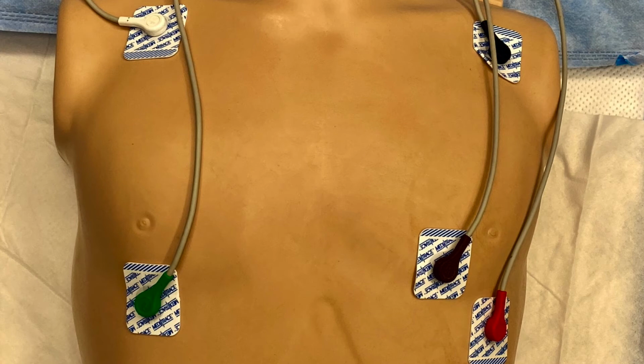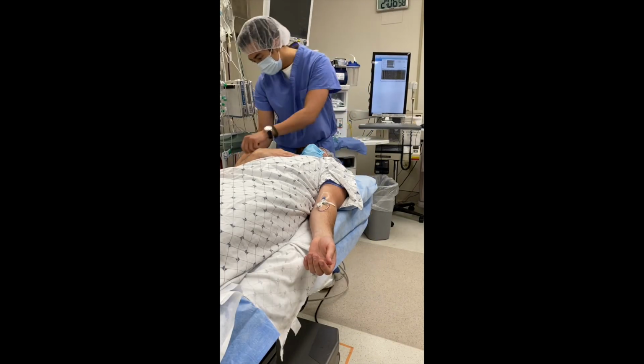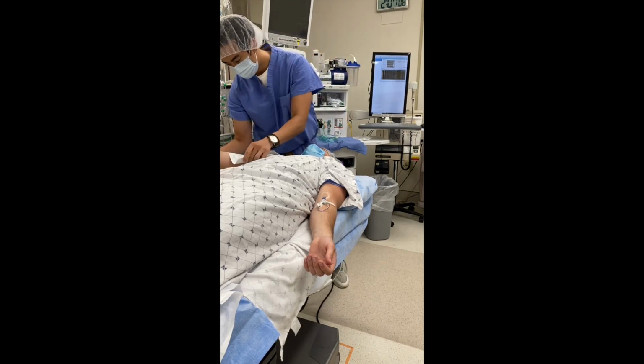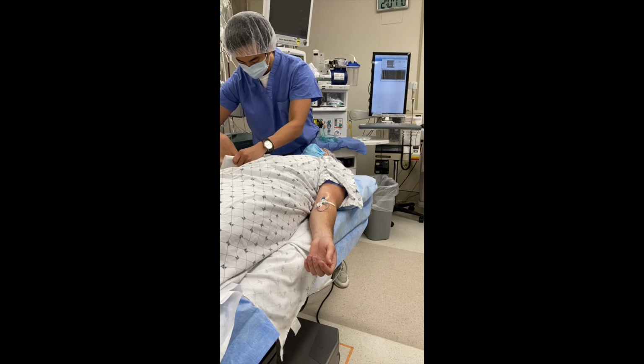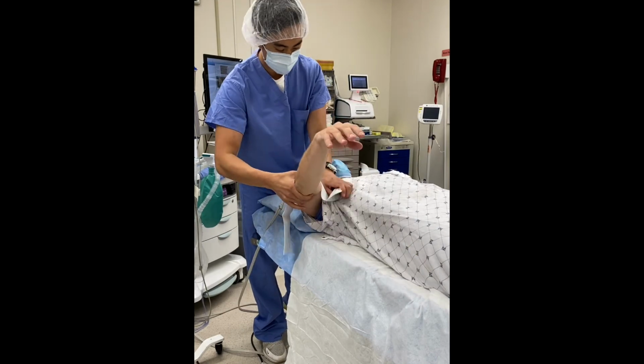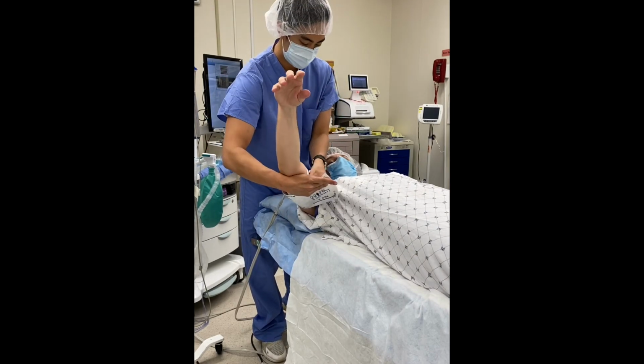This shows the correct placement of the electrodes. The blood pressure cuff should be applied to the bicep of the arm opposite of where the IV is. Keep in mind the position of the blood pressure cuff sometimes changes depending on the patient and procedure, such as if the patient has a limb restriction or if the arm is the operative site.